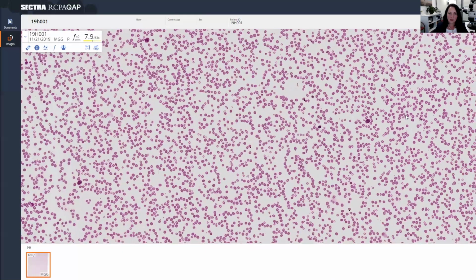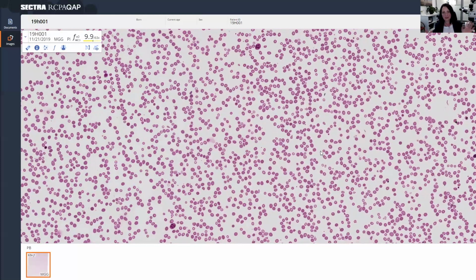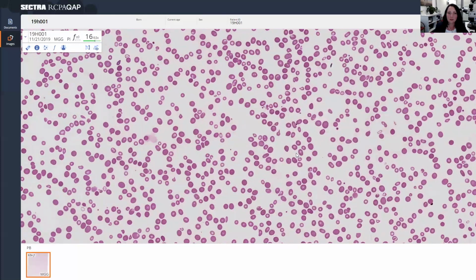So when we're looking at a macrocytic anemia, we have the sort of basic differential of megaloblastic anemia, and so that can be related to B12 folate deficiency, medications such as Hydrea or methotrexate, and with the hypersegmentation, we're sort of thinking more towards a megaloblastic anemia. If we didn't have hypersegmented neutrophils, or if we had some neutrophil dysplasia, that might point us more towards an MDS type picture.